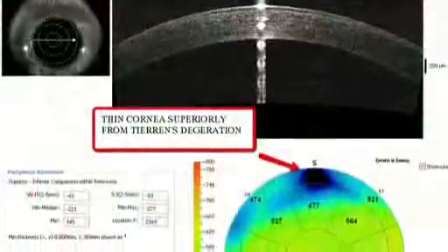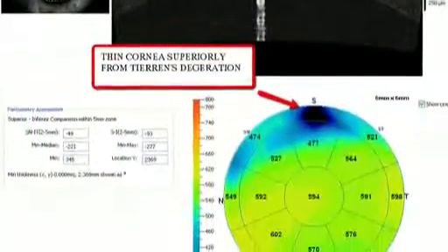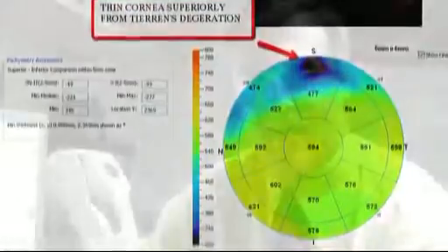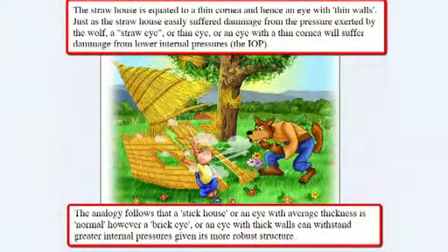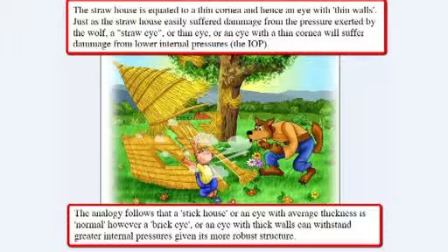One thing we do in diagnosing glaucoma is we measure the thickness of the cornea. And the OCT does a great job of performing that test for us. I like to say that glaucoma corneas come thin, average, and thick, much like the three little pigs had a straw house, a stick house, and a brick house. The three little pigs had houses made of straw, sticks, and bricks.